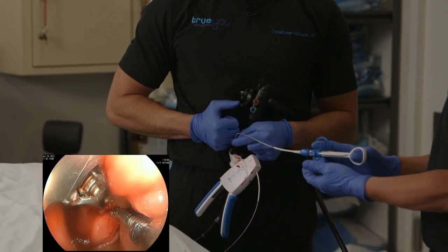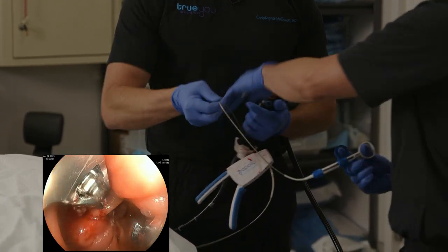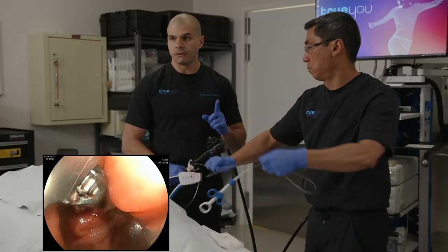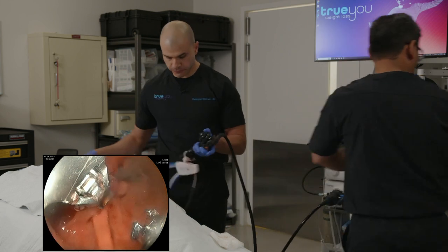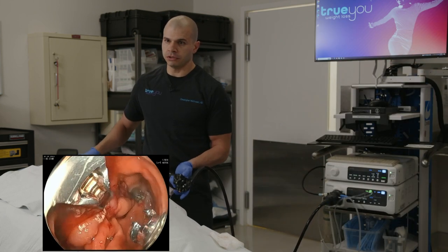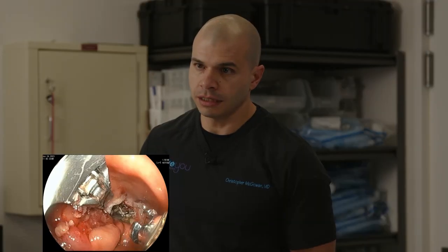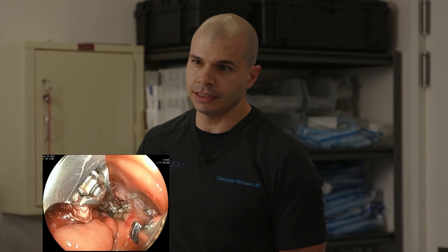So I'm cinching this final suture, and we'll go ahead and do that there. So that's cinched. Okay, now let's take a look here. So pouch, much smaller. I think you have a sense of that. Outlet is very small but patent. And then this will heal exactly in that size.